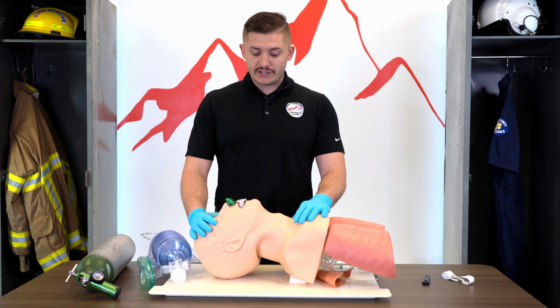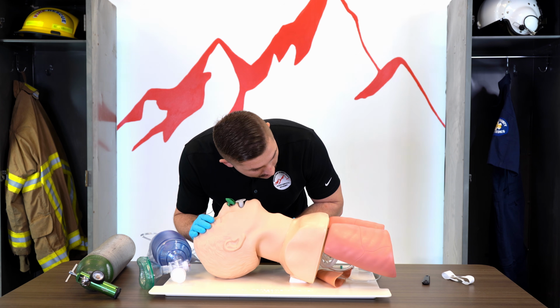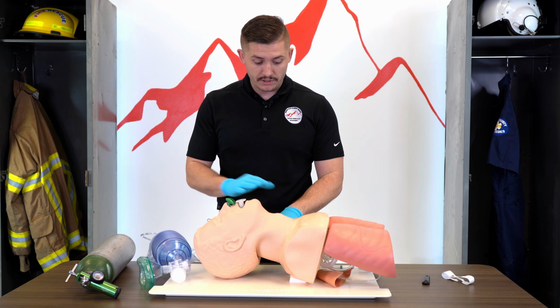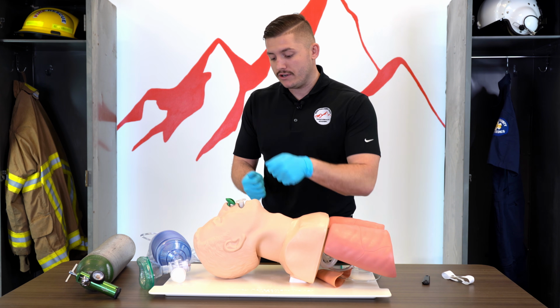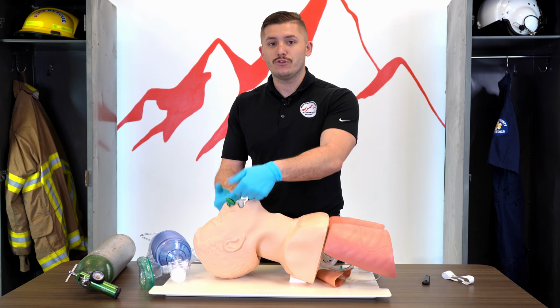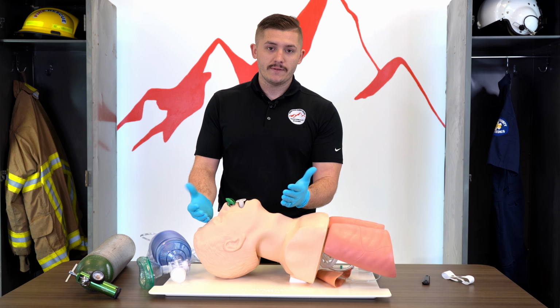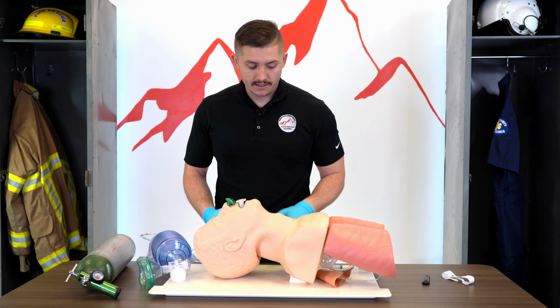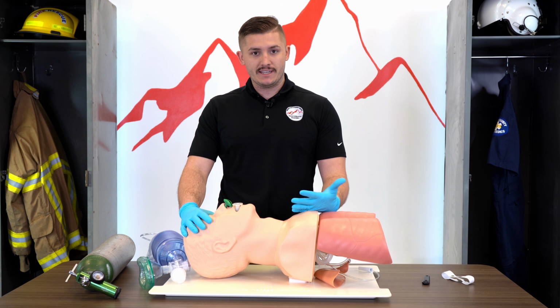Now, when we come to a patient like this, we do our AVPU, right? Sir, can you hear me? Hello, hello, hello. Okay, they're not responsive. They have a pulse, but they're not breathing. This chest is not moving up and down. So if I put a non-rebreather on this patient or I put a nasal cannula on this patient, it's doing nothing for my patient because that oxygen isn't going anywhere, right? They're not ventilating, okay? So if my patient isn't breathing, I now need to ventilate them.